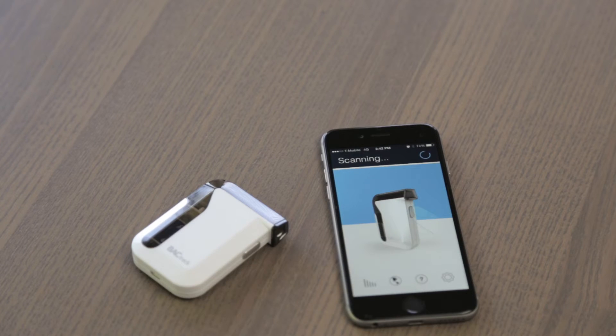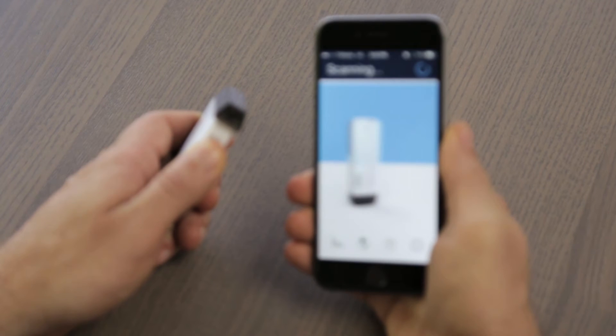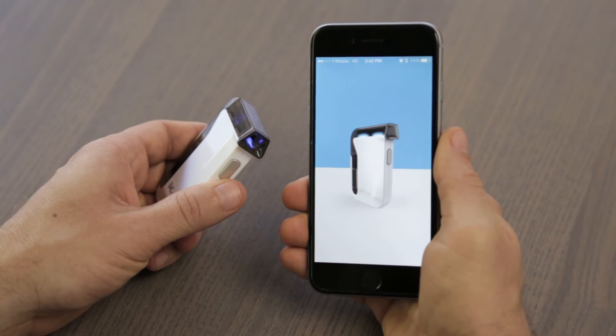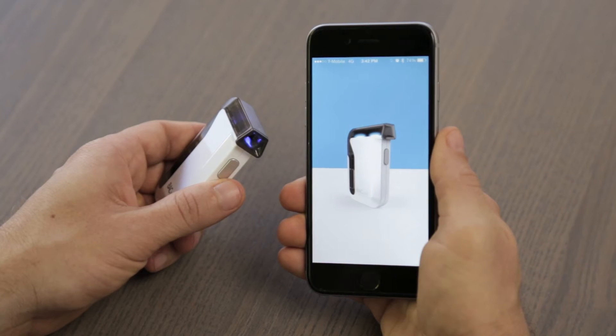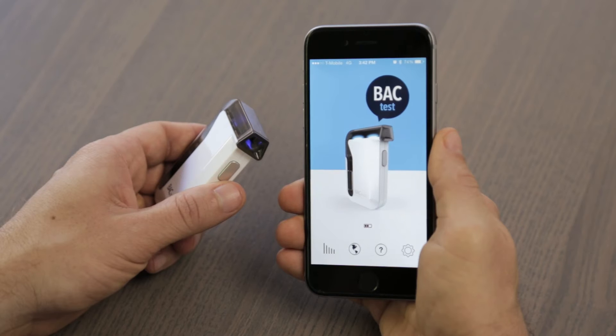When you open the app, you'll notice that it's rotating between two different products: BACtrack Mobile as well as BACtrack VO. The app is fully compatible with both products and will automatically recognize which breathalyzer you're using as soon as you turn it on. Once paired, tap the dark blue circle to begin.